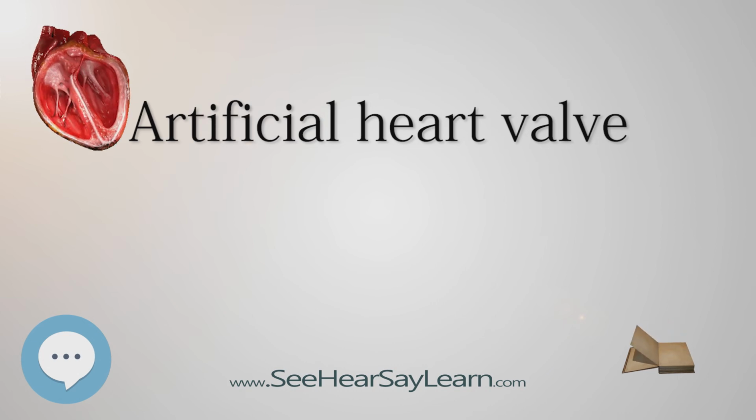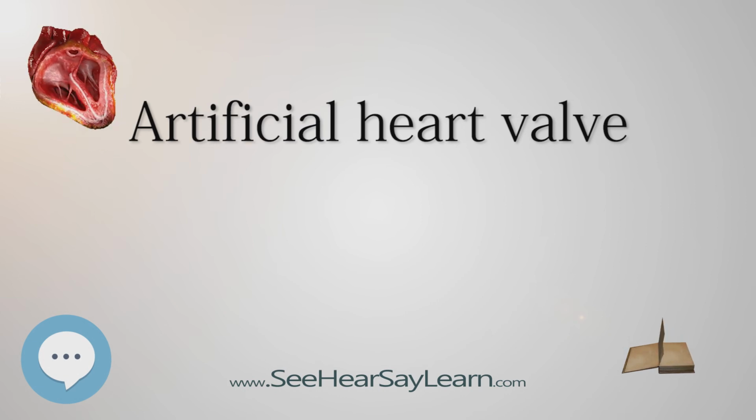Durability. Mechanical heart valves have been traditionally considered to be more durable in comparison to their bioprosthetic counterparts. The struts and occluders are made out of either pyrolytic carbon or titanium coated with pyrolytic carbon, and the sewing ring cuff is Teflon, PTFE, polyester, or Dacron. The major load arises from transvalvular pressure generated at and after valve closure, and in cases where structural failure does happen, it is usually as a result of occluder impact on the components.